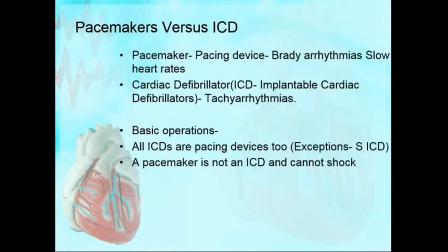Okay, we'll come here. So what is a pacemaker? What's an ICD? That is a common question. Many of you know this, third year residents know this, but for some of the interns, you have to know this also, because sometimes patients know more than you guys. It's, doc, I have a pacemaker, and you did not know about it. So what is the difference between a pacemaker and an ICD?